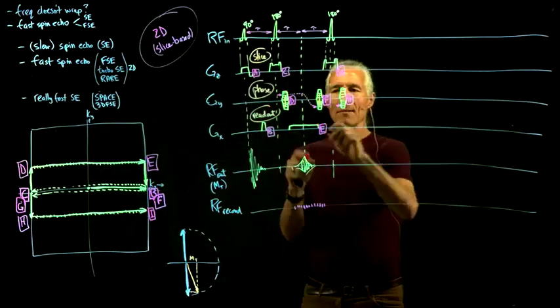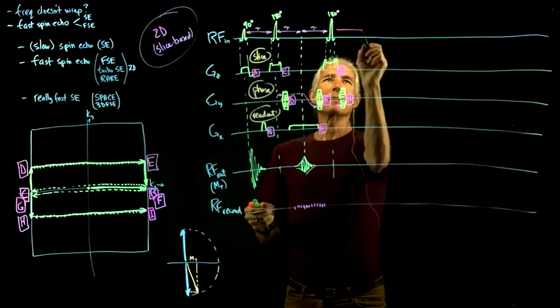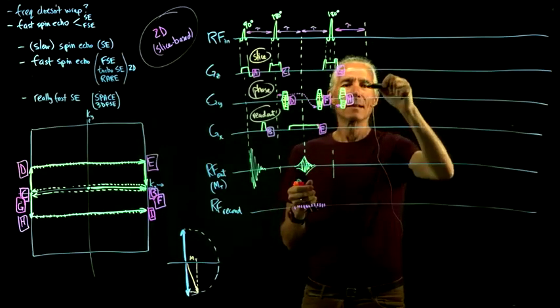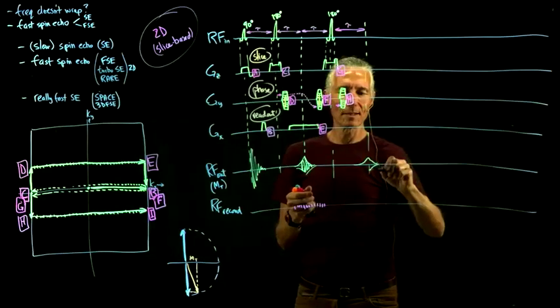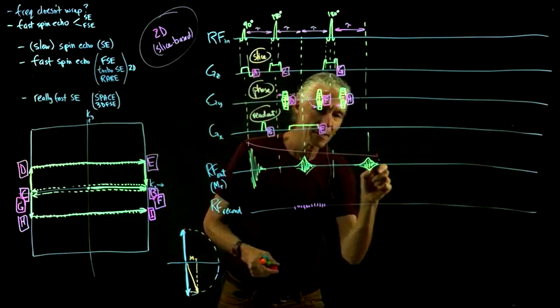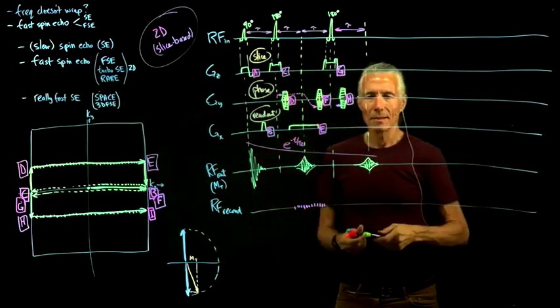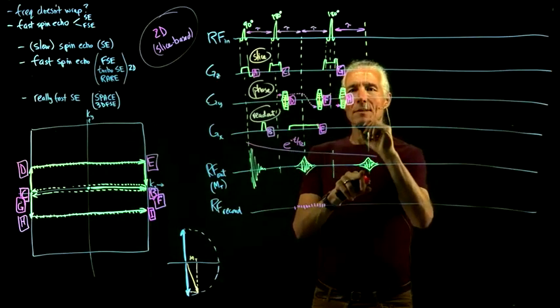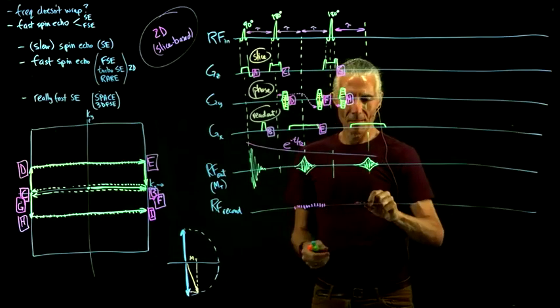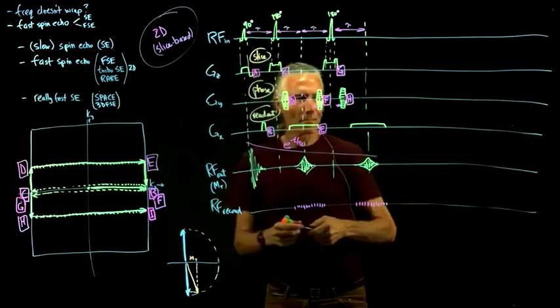So that would be this thing again. So here's this amount of time later. There's another echo happening down here. So it's a smaller echo because there's more T2 decay. Because here's our e to the minus t over T2. And so while that echo is occurring, we've turned on our gradient, and we're recording another little burst of data here. So by the time we're done, it gets to point I.